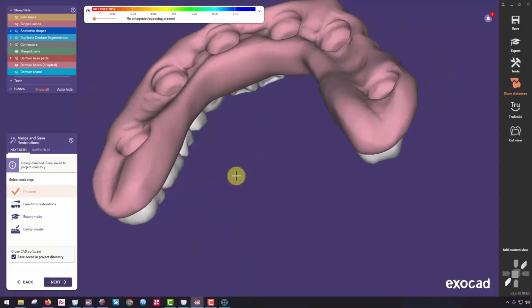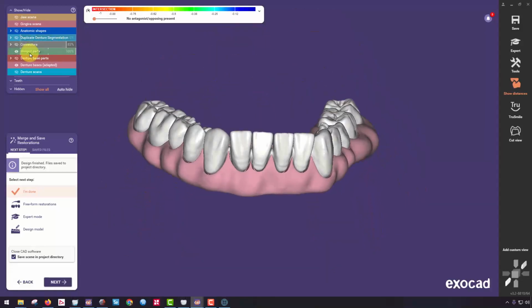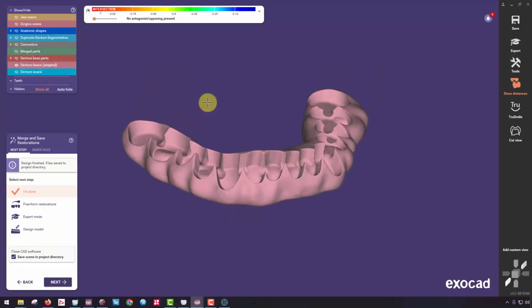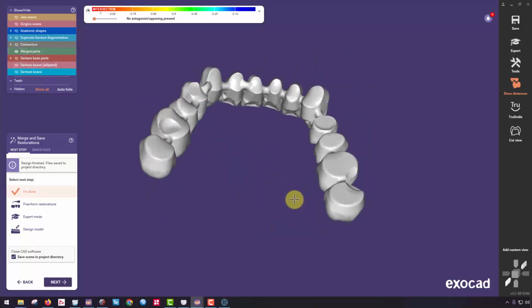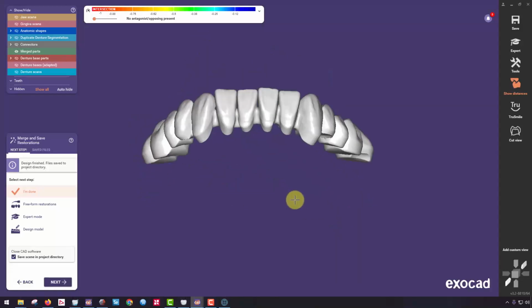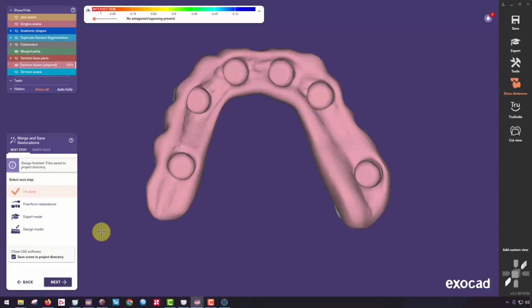Taking a look at my prosthesis design. And now I have merged parts, which is the teeth. And then here is the denture base adapted part. And then here is just the merged part. This is the tooth arch segmented out. And then my denture base segmented out.